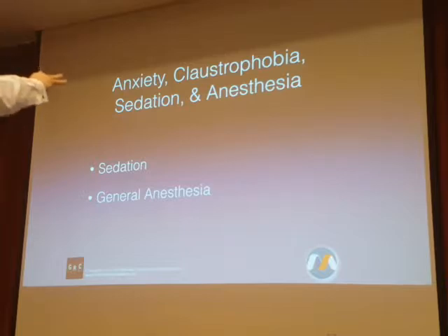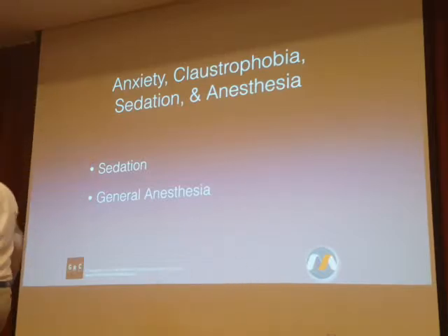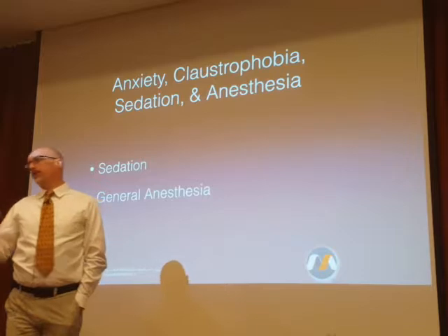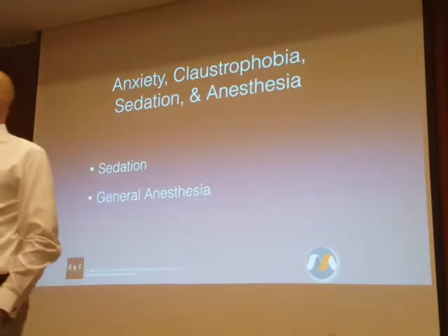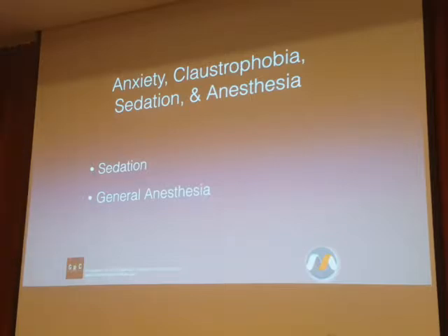When we go to anesthesia, heavy sedation or general anesthesia, now all of a sudden we're actually compromising the regulatory functions of that patient's body. You may compromise respiration. And so we're going beyond just potentially impairing their cognitive functions and reducing their ability to be constructive in their own safety. Now we're actually talking about impairing their physiologic function.